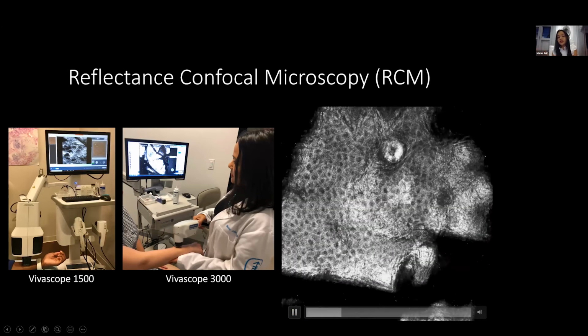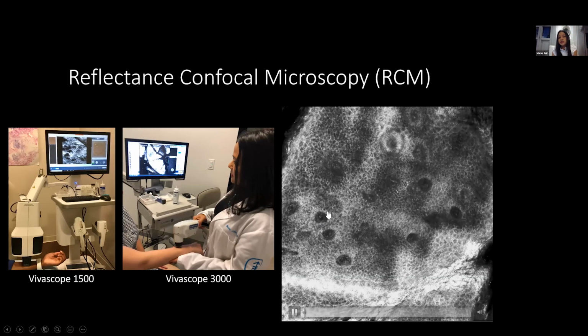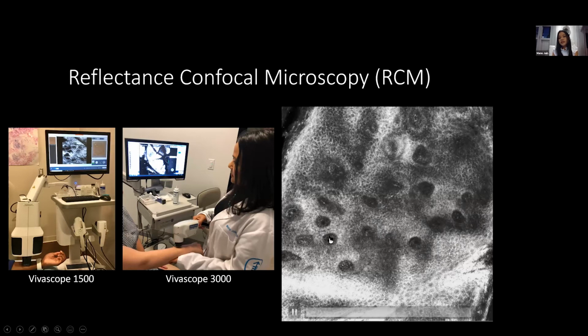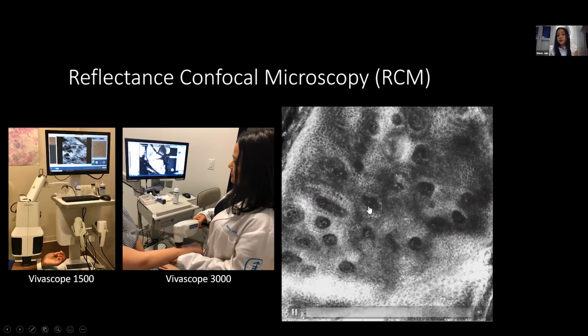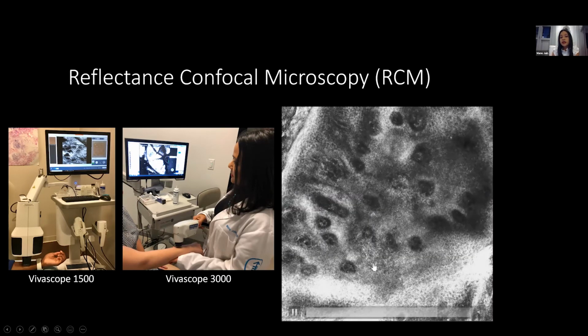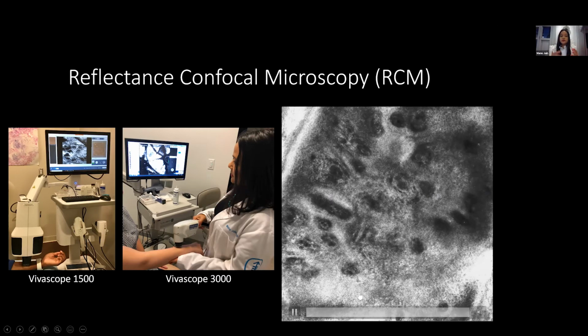I'm not giving a lecture on histopathology or confocal microscopy here, but the bottom line is how beautifully we are going from the top layer down, and this is a junction where most of the cancers originate. Do you see these flickering cells? These are blood vessels. It's a beautiful phenomenon that you can see in real time while imaging. Now it's going into the dermis, where people have collagen and want to put collagen creams, etc. It goes up to 200 microns.